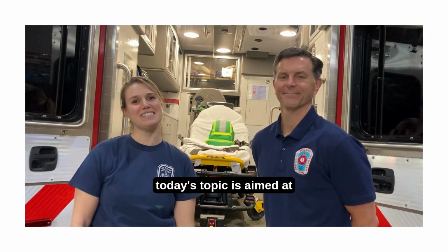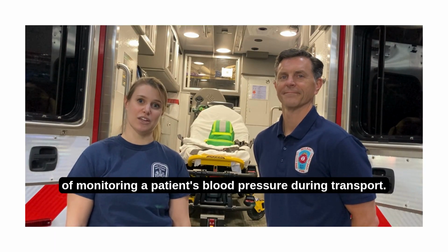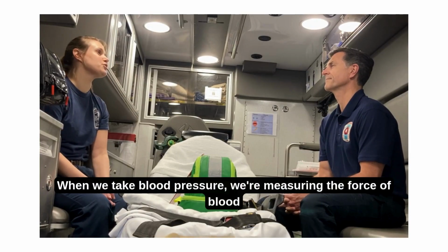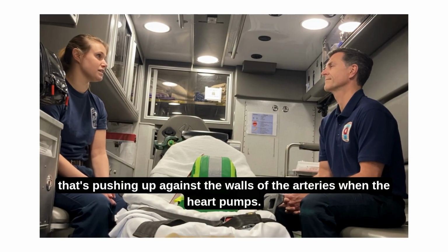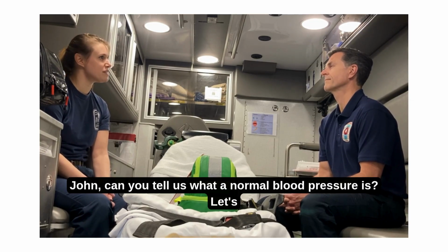Hi. Today's topic is aimed at helping EMTs understand the diagnostic value of monitoring a patient's blood pressure during transport. When we take a blood pressure, we're measuring the force of blood that's pushing up against the walls of the arteries when the heart pumps. John, can you tell us what a normal blood pressure is?